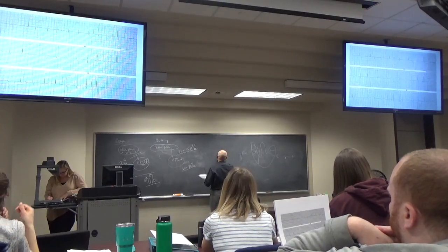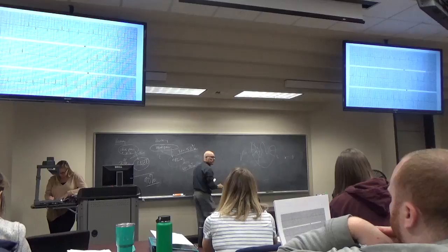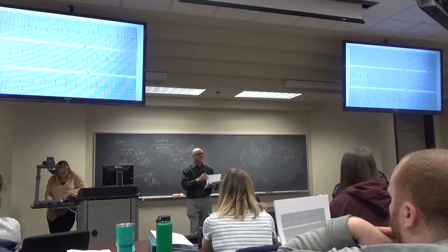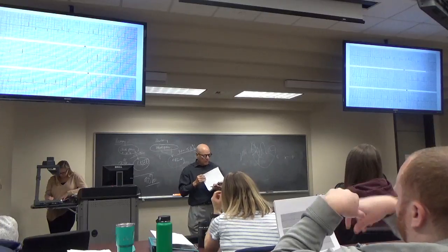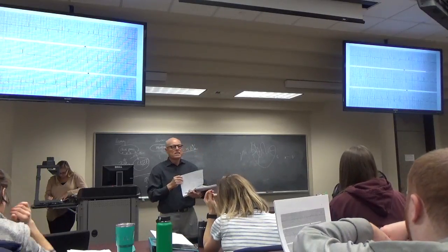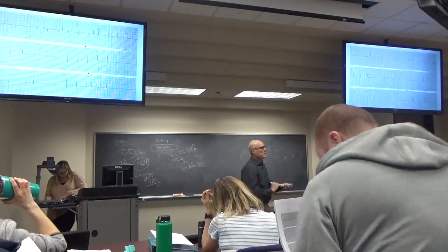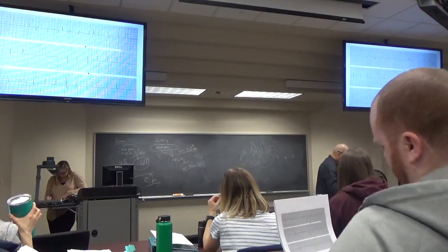Left atrial enlargement just looks different. It's usually smooth. This one is not smooth. This one's kind of jerky. Weird, yeah. Okay. Thank you. Good question. If you said left atrial enlargement on this, it wouldn't be a wrong answer. Okay. 7-2.